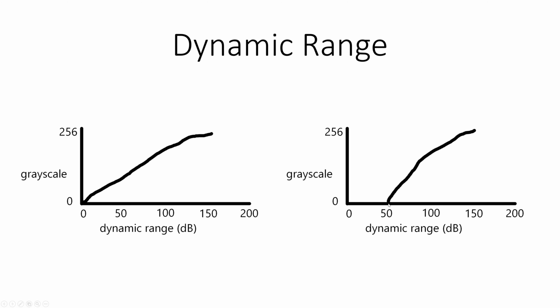It's going to exclude more sound intensities from what actually ends up getting displayed on the screen. So for the first 50 decibels of sound that the machine hears, from anything below 0 it can't hear, up to 50 decibels of sound, or 10 to the fifth, 100,000 times stronger than the very softest sound it can hear, all of those are just going to be assigned a grayscale of 0. They're just going to appear anechoic and black.